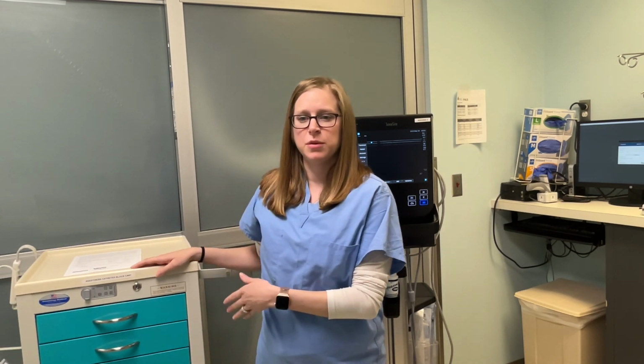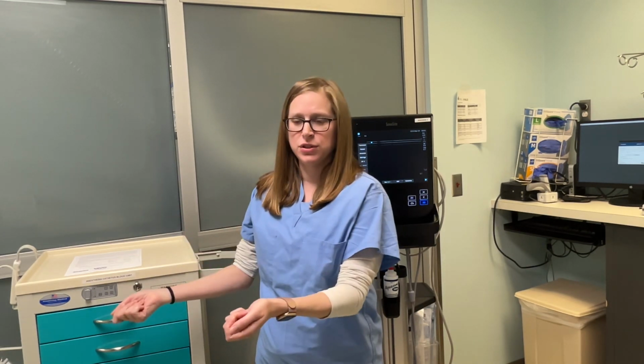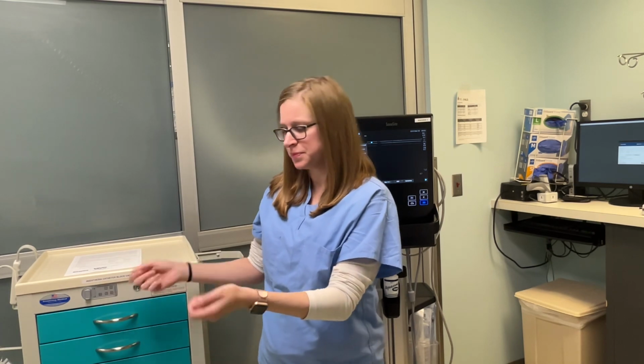Make sure to go through and familiarize yourself with the block cart, because during the procedure you may be asked to get something for anesthesia and using a sterile technique, place it into the field for them. On the opposite side of the stretcher, the nurse will be standing with the ultrasound on the opposite side of the bed. For rib fractures, there are a couple positions that we will place the patient in. The most common being sitting on the side of the bed or on a lateral position, and this is up to the anesthesiologist's preference, and it's the nurse's responsibility to position the patient for the procedure.